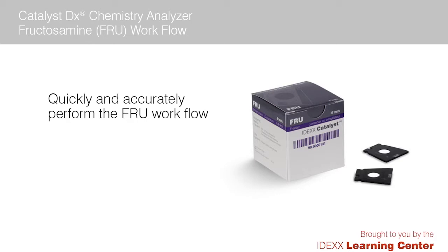In this video, we will demonstrate the proper way to run a fructosamine slide on your Catalyst DX chemistry analyzer. As you'll see, the process for running fructosamine is the same as most other Catalyst slides.